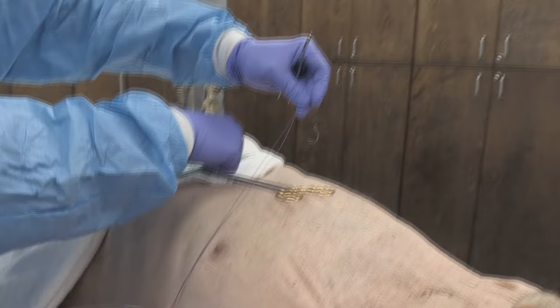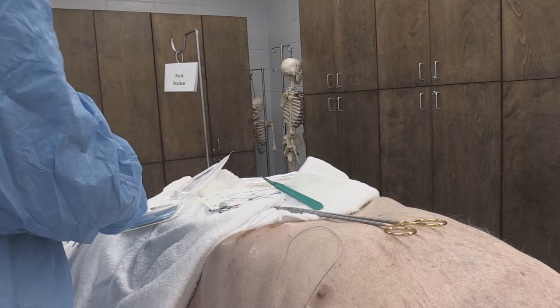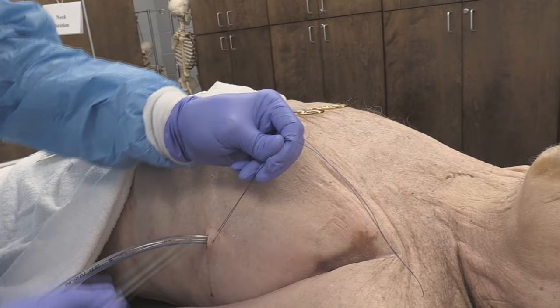I'm going to cut the needle — I've got that off. Ensuring that — and I'm going through this slowly; obviously in a real situation we are going to do this a little quicker. So I've got two equal pieces of thread. I have the purse string in place, and you can see the purse string here.